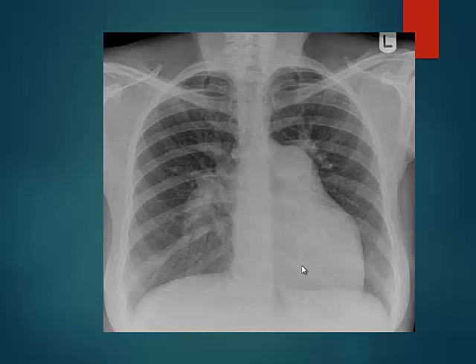Essential or idiopathic, or secondary. Yeah. So this is idiopathic pulmonary arterial hypertension. Idiopathic, because pulmonary arterial hypertension is a broad term, isn't it? Whichever condition you have with raised pressure in the pulmonary artery, you could call pulmonary arterial hypertension. But probably idiopathic pulmonary arterial hypertension is what would cause massive enlargement of the central pulmonary arteries.